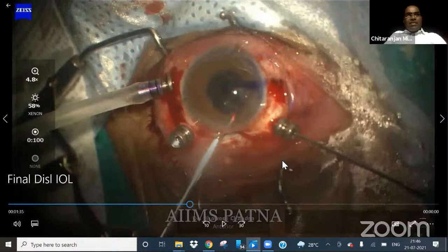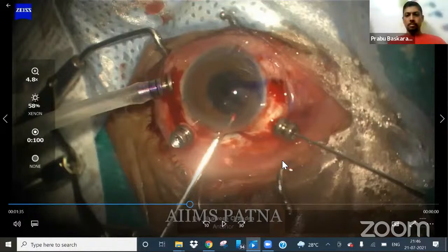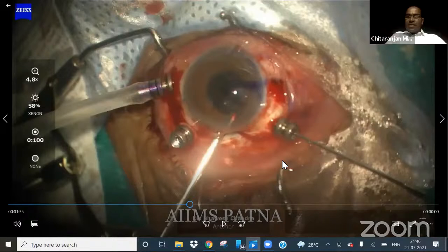Almost similar, but I'll tell you, if it is a three-piece rigid IOL, and I'm planning to do the scleral fixation of the same IOL, then there is no need to explant it. I can put it in the scleral tunnels. But if it is a foldable IOL, as Dr. Abhishek has shown in the video, you just take it like that.